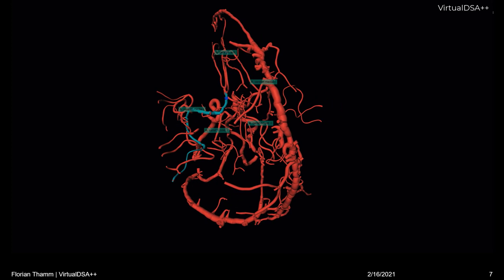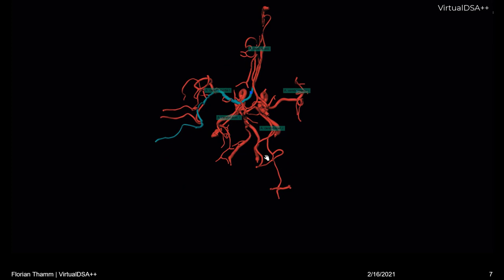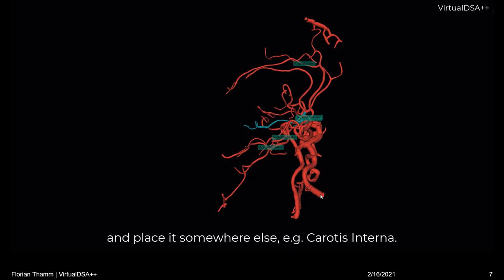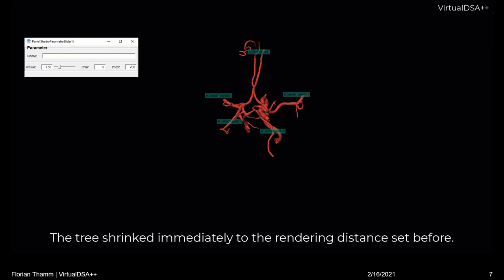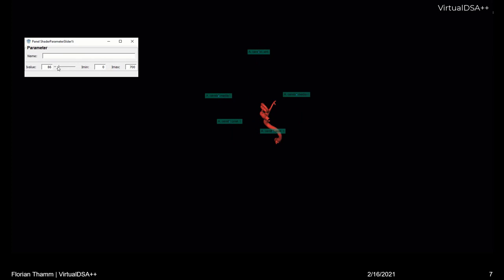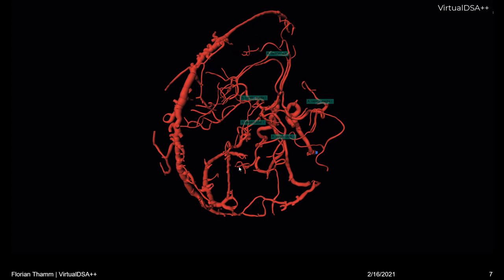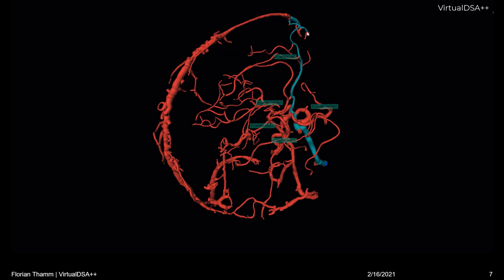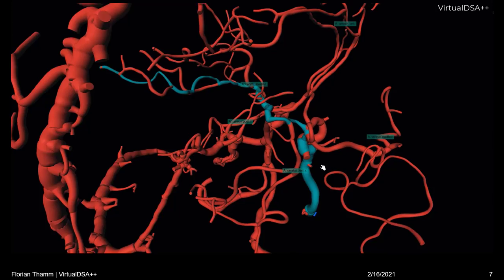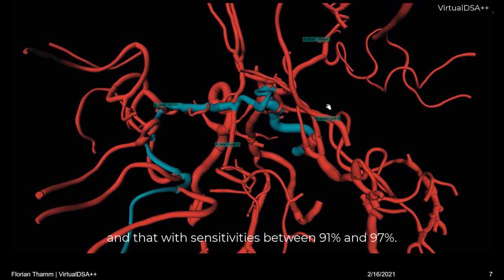We can reduce the model again to the relevant part, namely the circle of Willis, and replace the root node, for instance, into the carotis interna. This is the place where it makes more sense for planning mechanical thrombectomies. We already saw that the model changes immediately because we have a different reference point now, thus a different vein suppression model. With this subject, all labels are available and set correctly. In a preliminary experiment, we determined sensitivities between 91% and 97%, depending on the vessel, in terms of placing accuracy.